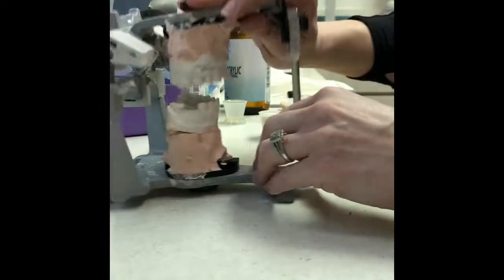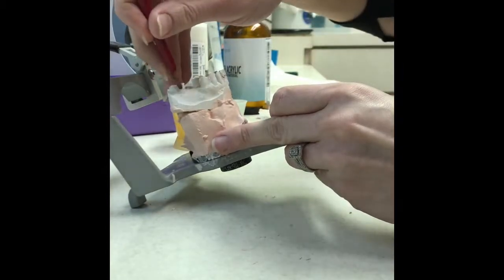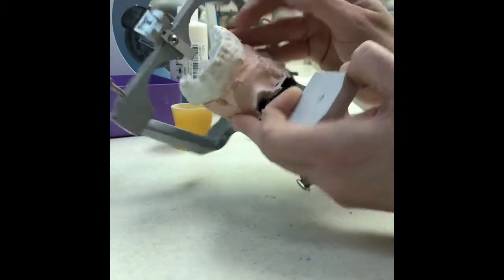And then we prepare our casts. So in the front we want it to be about halfway down the teeth, and the back about the same. So we mark this first on the cast.